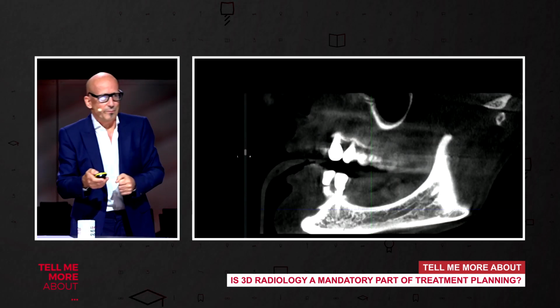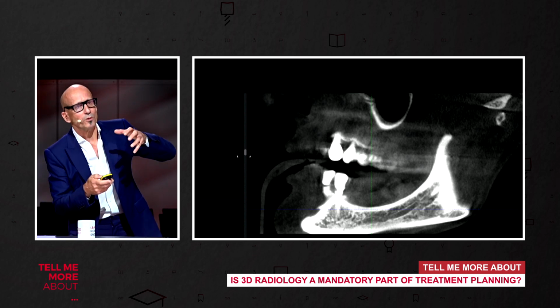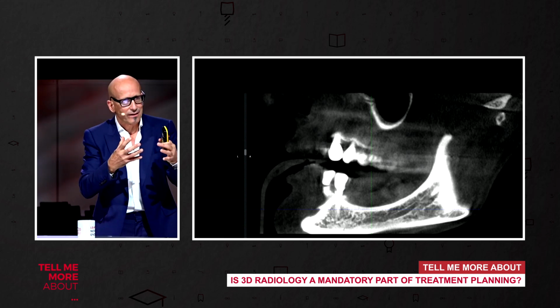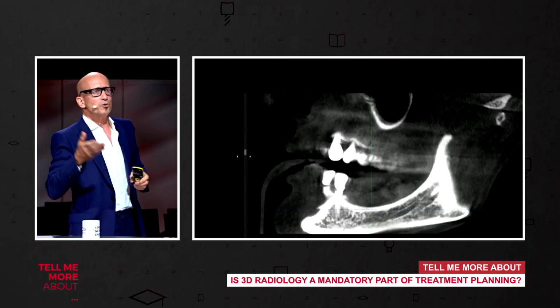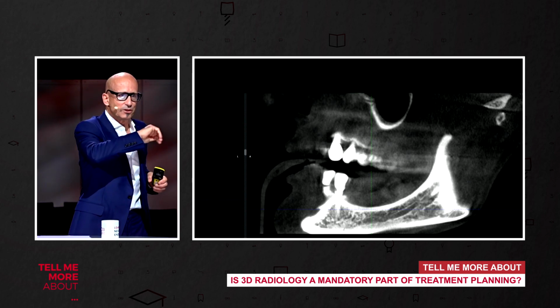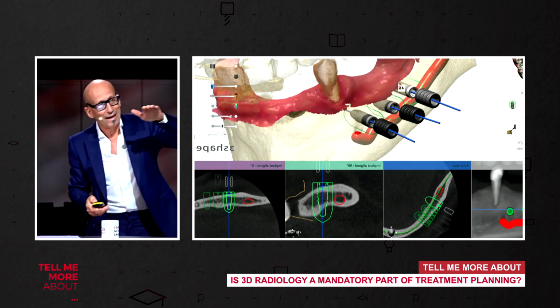So you analyze, you can see 4 or 5 millimeters of bone above the nerve. Now we can augment the bone with a new idea, converting our understanding of the digital world in another way. So now we place the implant above the nerve. So we plan something completely crazy. But this is a help for us to make later on a cut to the bone over the nerve. So being over the nerve, we use the navigation. And then this is the planning.